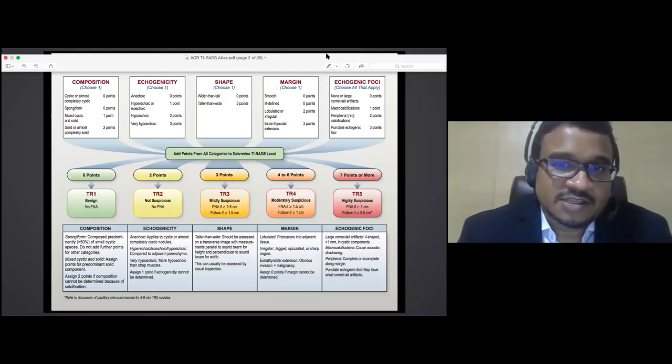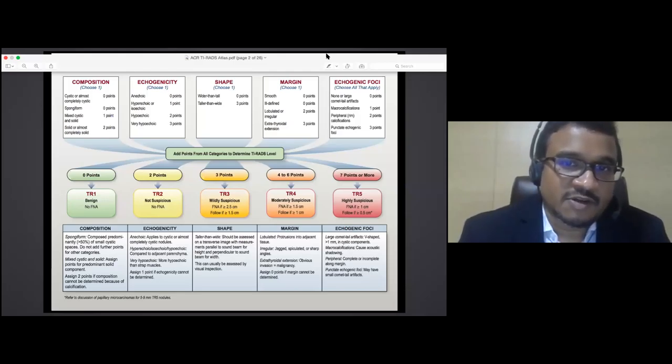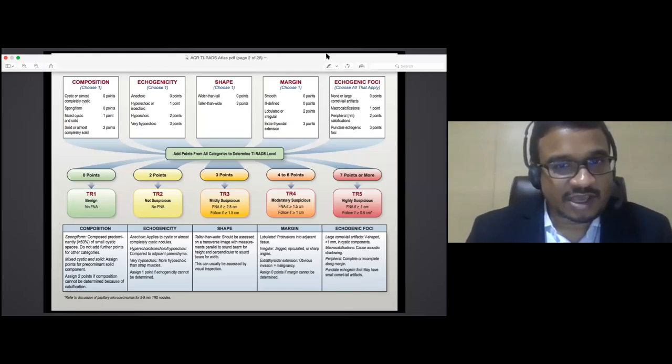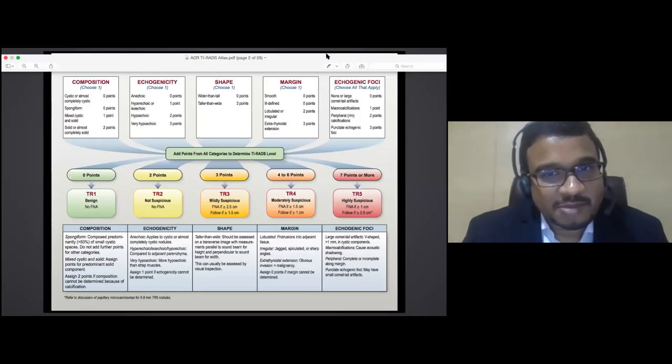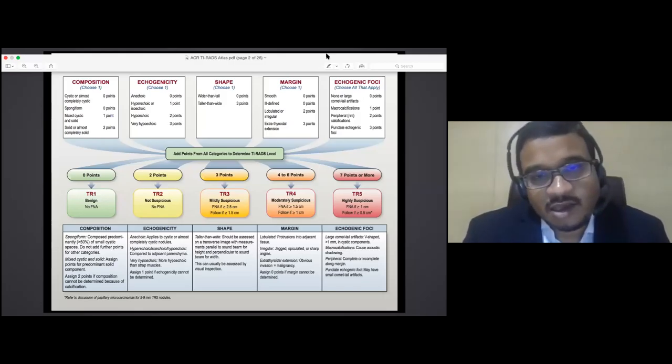This can happen if you're not doing a guided FNAC and you don't have an on-site pathologist. The pathologist should be sitting with you when you're doing a needle aspiration, and he'll tell you. When you do an ultrasound and feel that this looks suspicious, and you do a needle FNAC, then if you hit the right suspicious nodule, it's unlikely to be benign. If you don't have a pathologist at your disposal, or you're not using the ultrasound, you may sample the normal, isoechoic part of the nodule, and not focus on the hypoechoic or taller-than-wide lesion, and then you may get these samples.